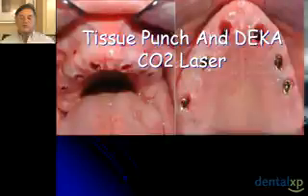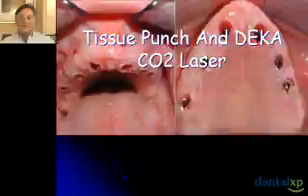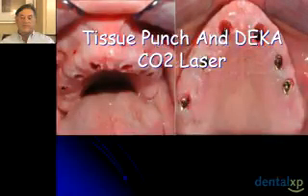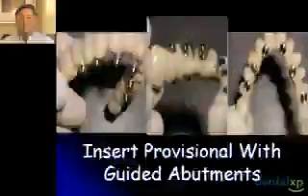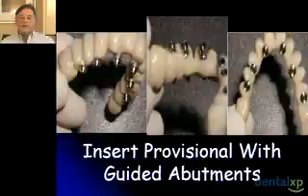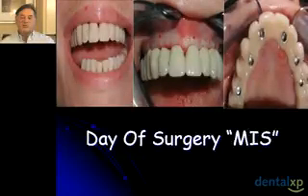And you see we have a well-groomed surgical site, minimally invasive. The surgery would take us about 30 to 45 minutes at most, and we have a flapless approach. Patient is very comfortable, and the case goes on very nicely. So my restorative teammate takes over, places the abutments on the provisional restoration, and this is the way she looks about 1 hour after therapy.